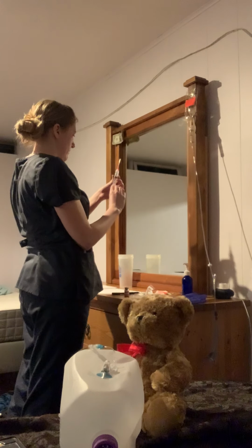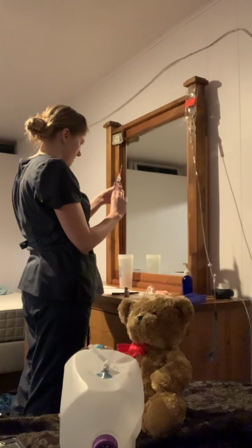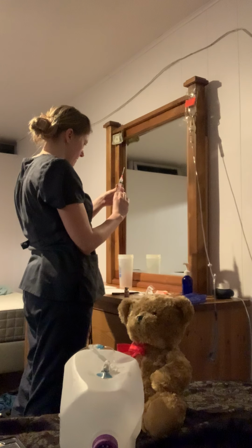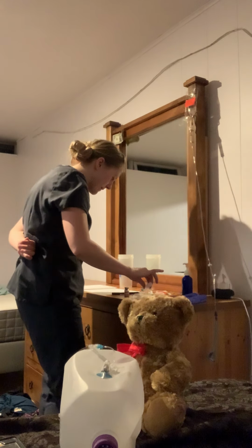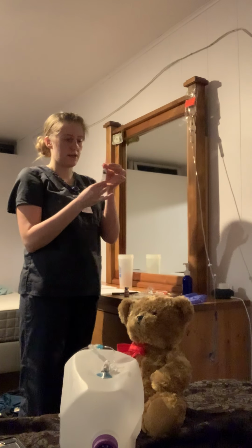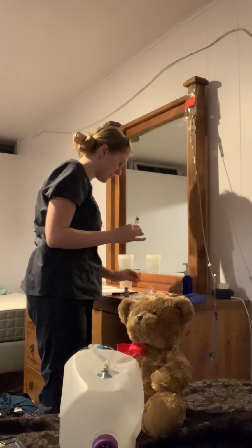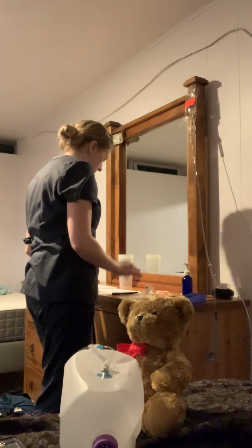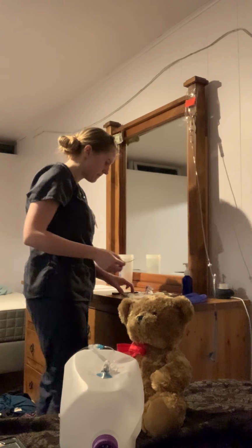And it's going to get rid of the air. And once I have my 4 mils, I'm just going to cap it again with one hand. And then I got my lid on, and then I'm just going to take this off the filter needle because I don't need it anymore. Now I'm going to do my second medication check.